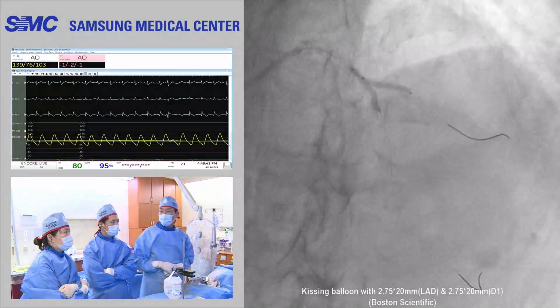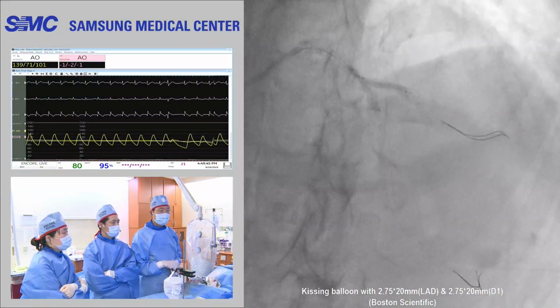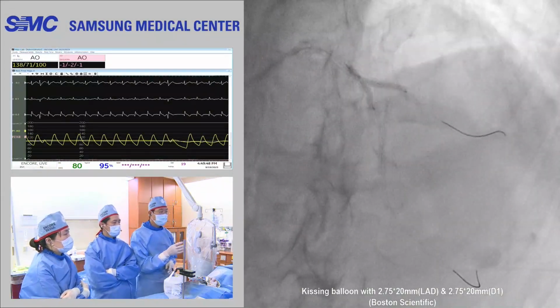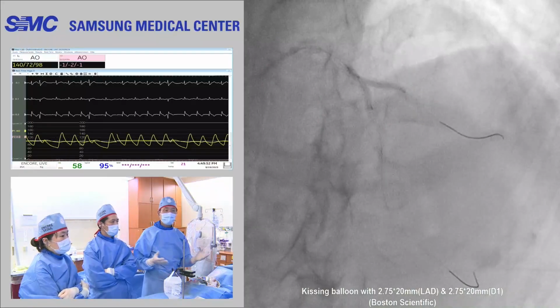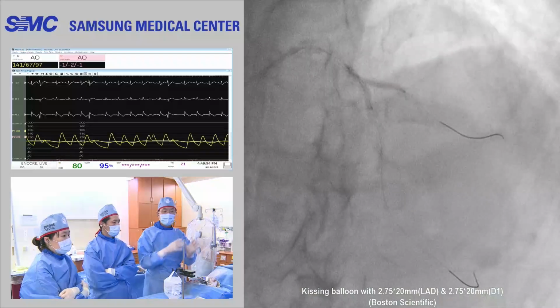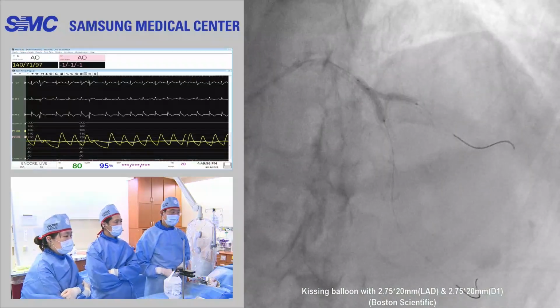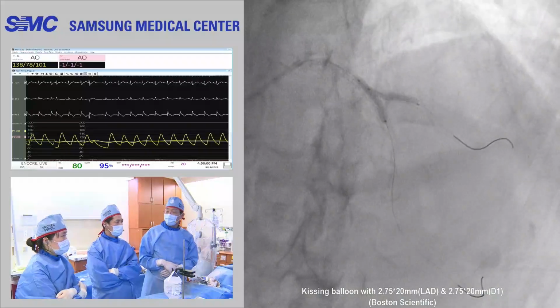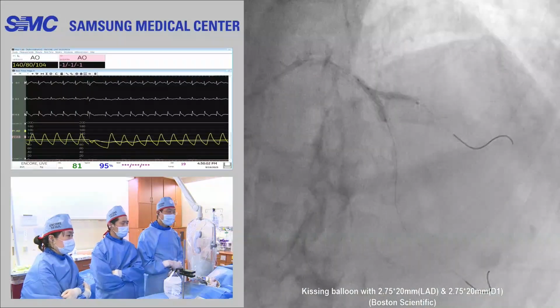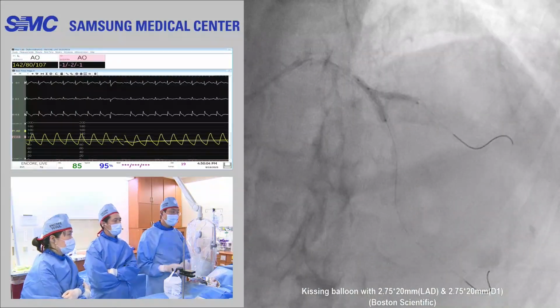The issue is that there is a possibility of overinflation and damage to the proximal part of the bifurcation. We saw a lot of calcification and the lumen area is just about 3. So this technique is similar to the previous, no overexpansion, minimal overlap, kissing ballooning.